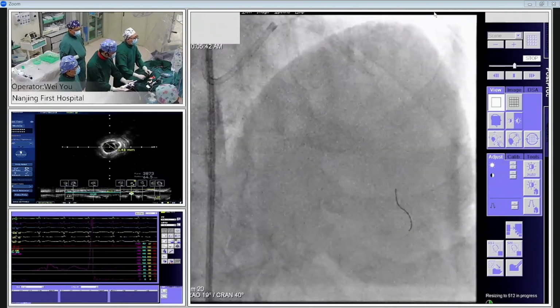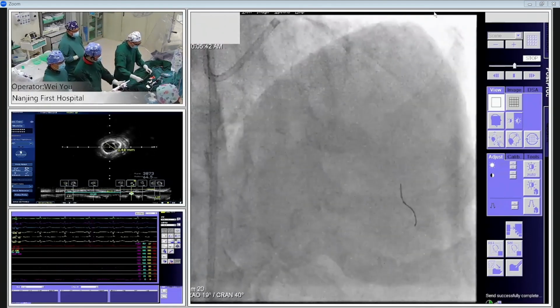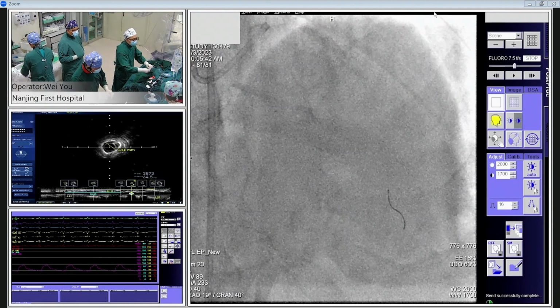Be careful. Just give me the microcatheter. With a low speed and maintain the wire tip at the distal area. Okay, Chief, we just use the microcatheter to retrieve the wire, to exchange the wire. Workhorse wire.